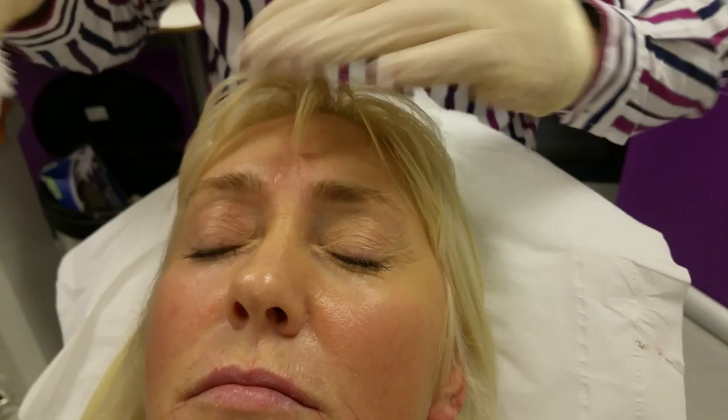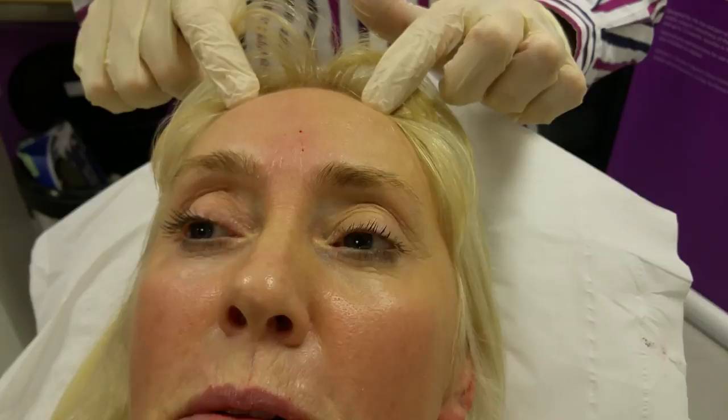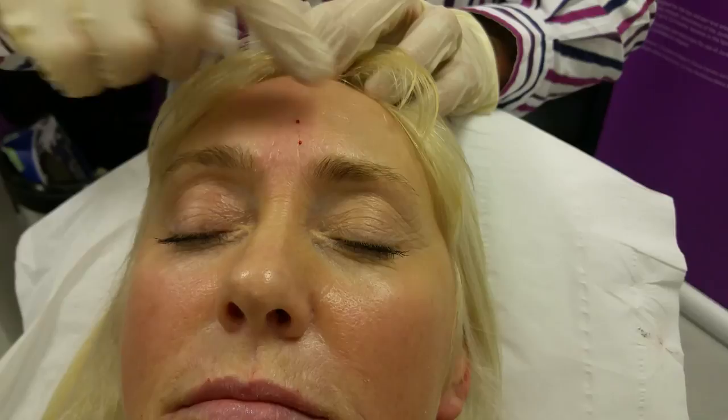Now we can just check the blood supply. The other issue — obviously we talk about blindness — but the artery normally runs up here, so you check the blood supply above and check for capillary refill. That all looks perfect because we haven't gone right near the artery — we were above it. And that's perfect. That's all done. Thank you.